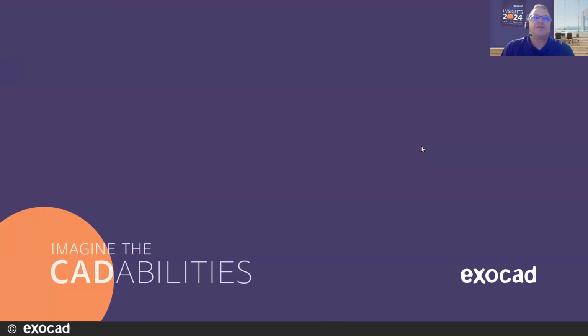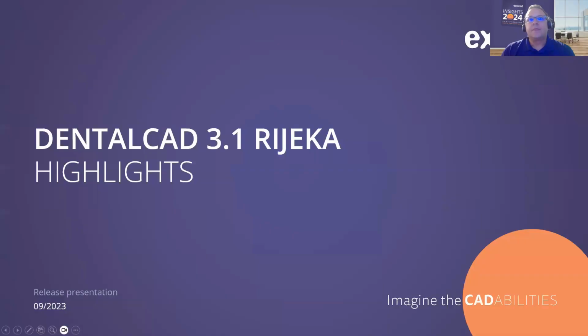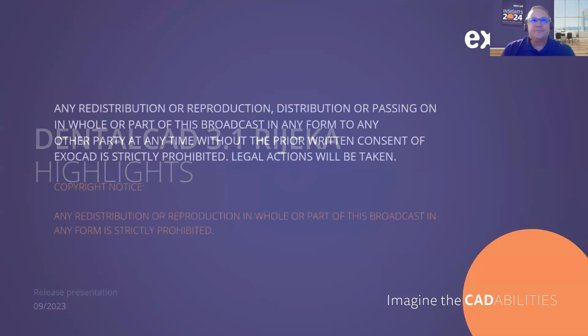So today we're going to show you some new features of our DentalCAD 3.1 Rijeka. So we're excited to share, and we hope you enjoy the webinar. Before we get started with the live demonstration, I'm going to just go over some brief slides here. Okay, so as I was saying, we're going to cover some highlights of DentalCAD 3.1 Rijeka.